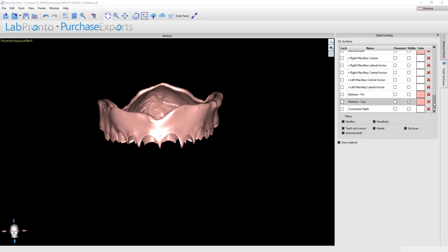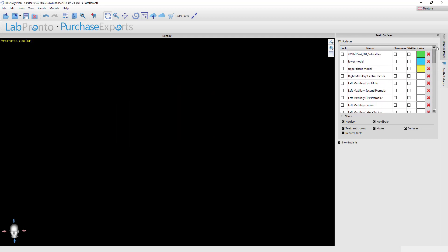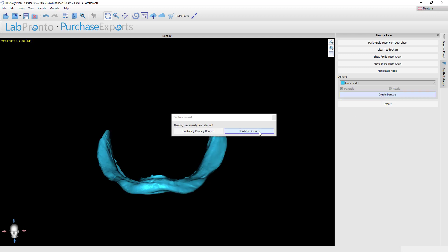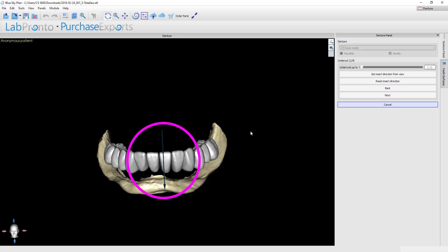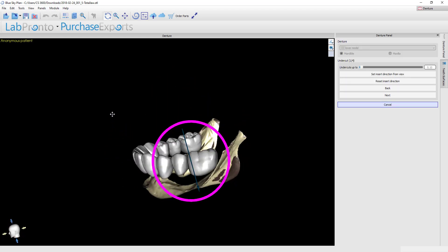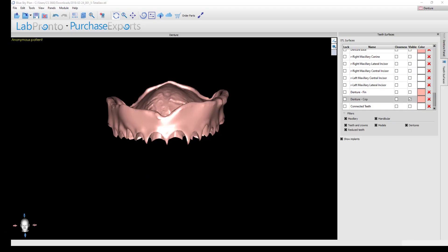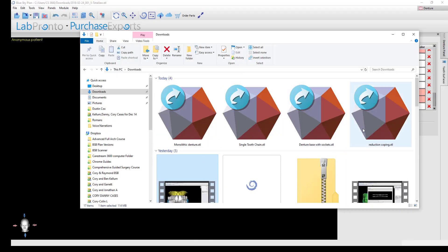For the sake of time I won't go through making the lower denture, but it's the exact same process. Turn on just the lower master model, go back to the denture design panel, build a lower denture, indicate it is a mandible, hit Create Denture, plan a new one, and it brings up the lower teeth. Then proceed through all the exact same steps on the lower arch.